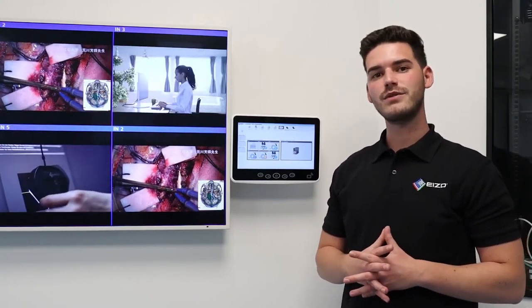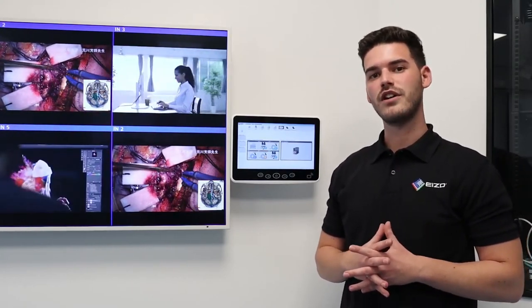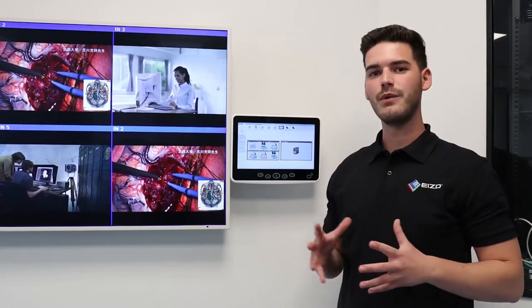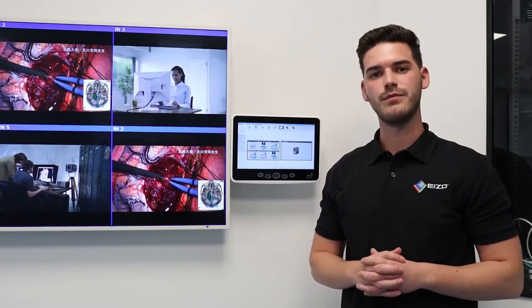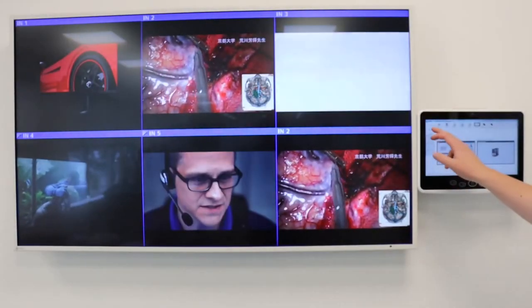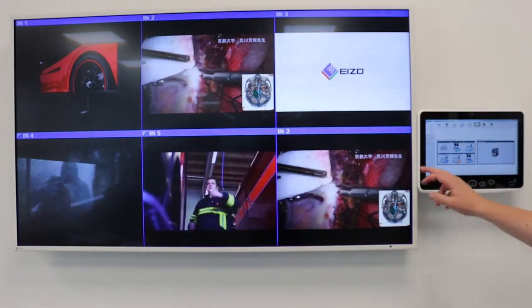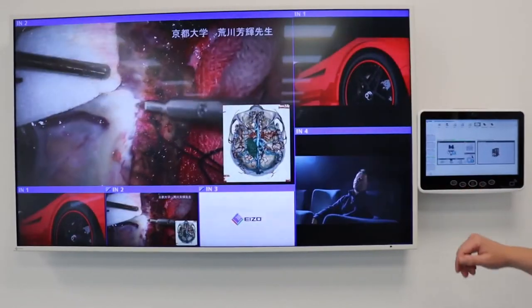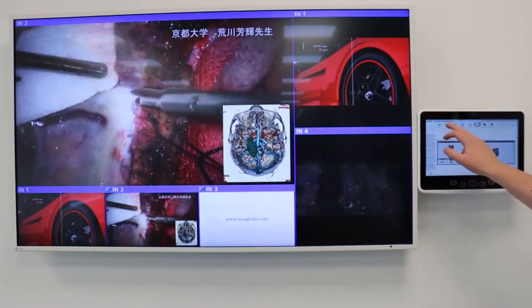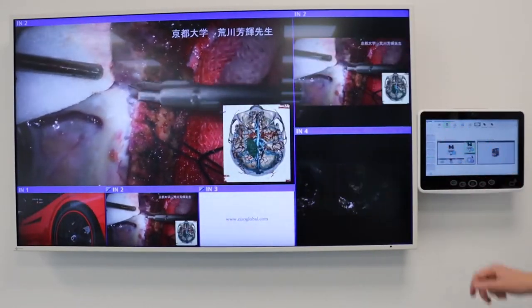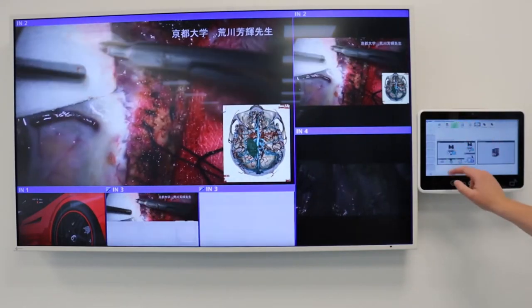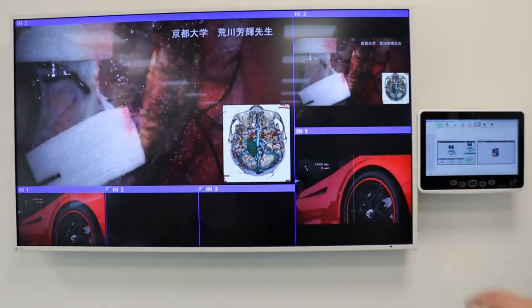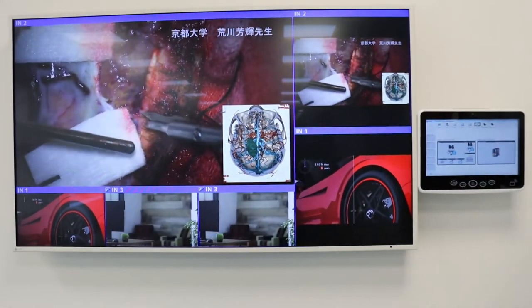It comes with a standard mounting of VESA 100x100 and can be mounted anywhere in the operating room. As you can see here, you can quickly and easily decide on different layouts for the output monitors using the predefined options on the left, and then have the ability to select which source from the top you wish to display.